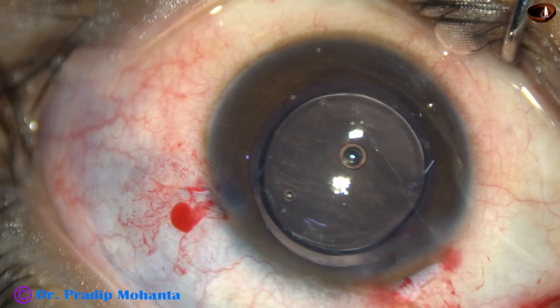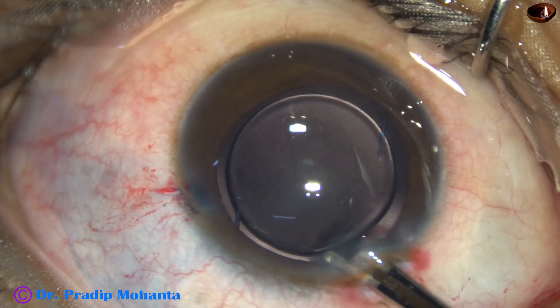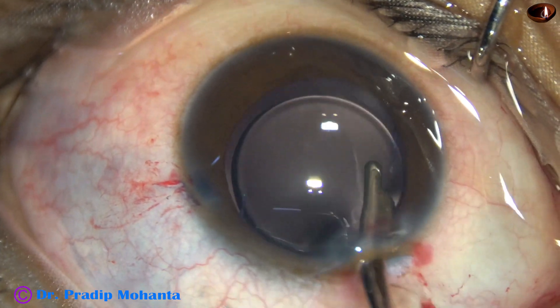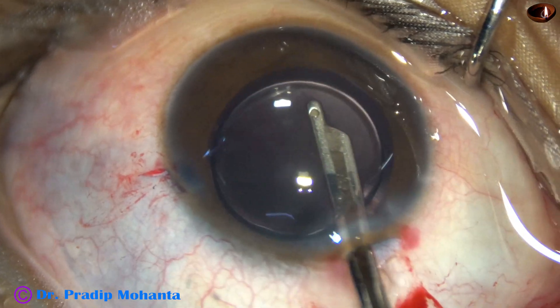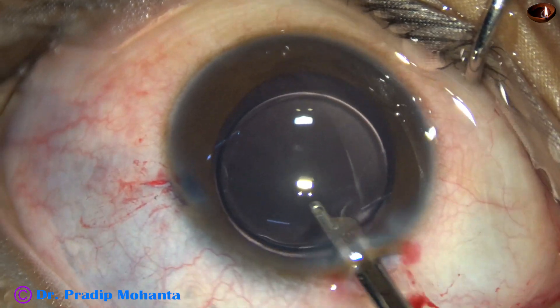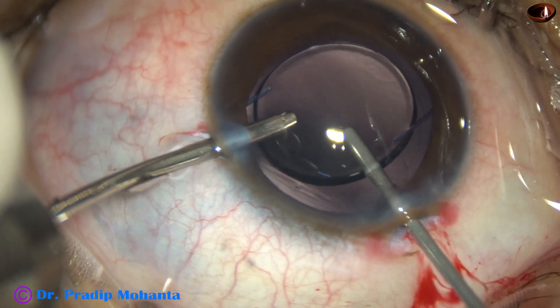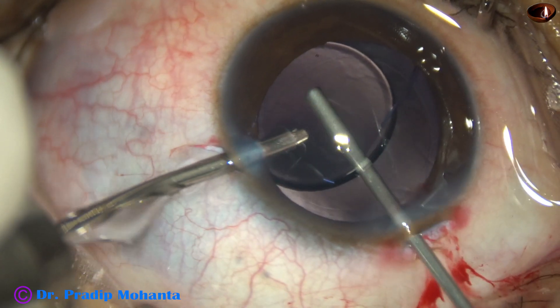I placed both haptics in the sulcus. Then the visco was removed by the Simcoe — from the capsular bag as well as from the anterior chamber. This is the advantage of vitrectorexis: it is much better than primary posterior capsulorexis because we can remove all the visco before doing the rexis.